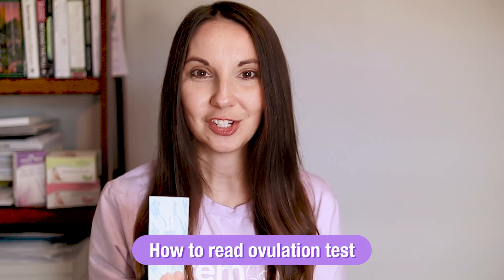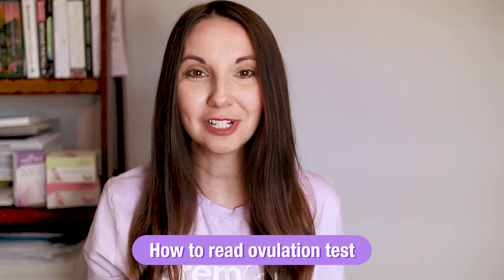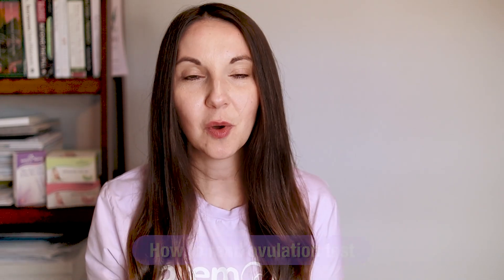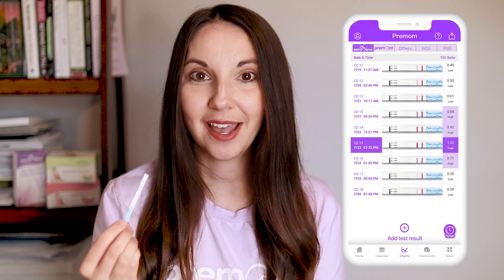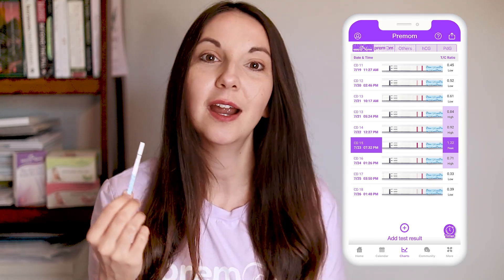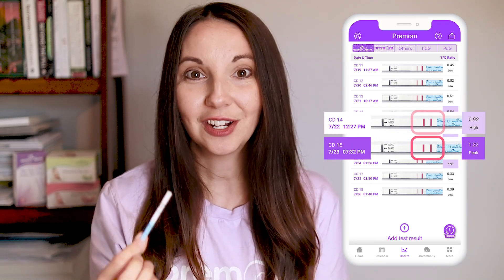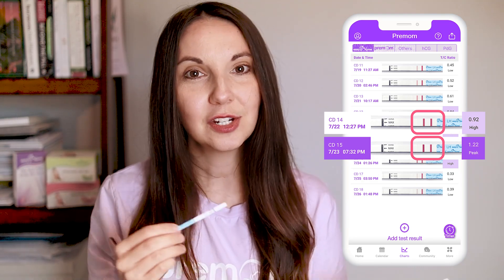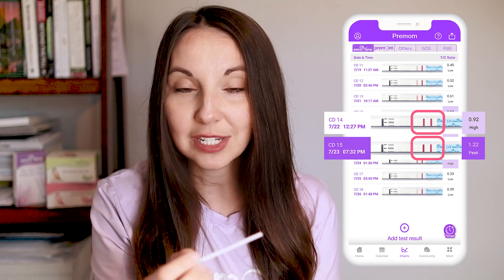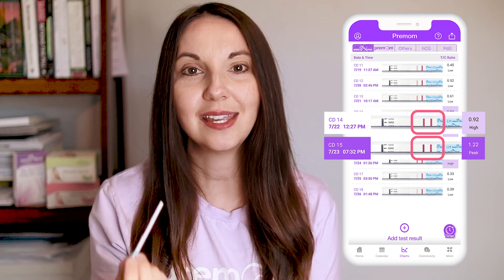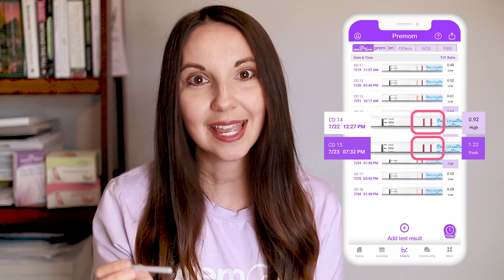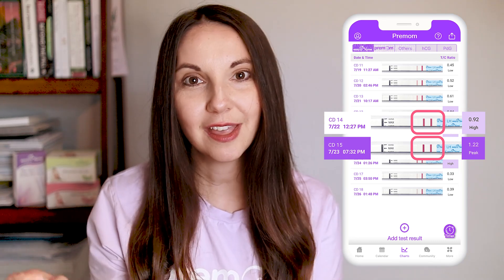How to read an ovulation test? This is a really great question, and lucky for you we have this amazing tool called the PreMOM app. The PreMOM app helps you identify if your test line is darker than or as dark as the control line, so there is no second guessing, no squinting your eyes to see if that test line is the same, greater than, or less than the control line.